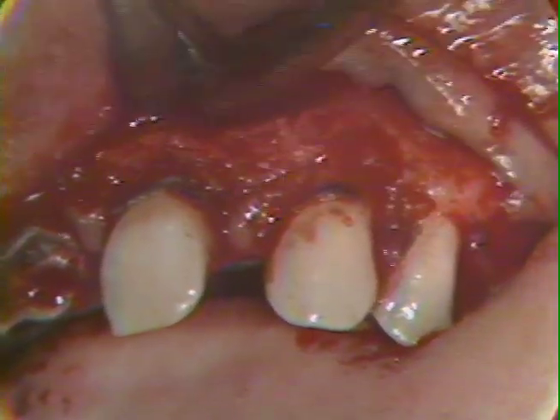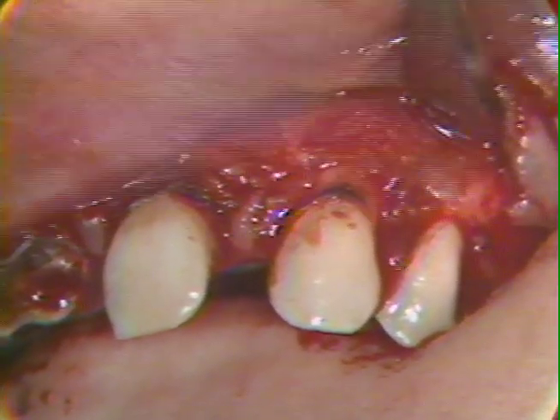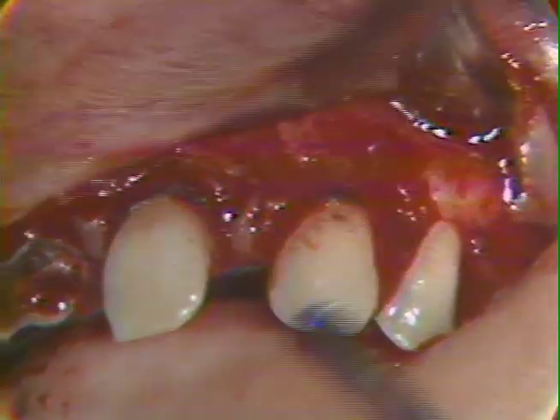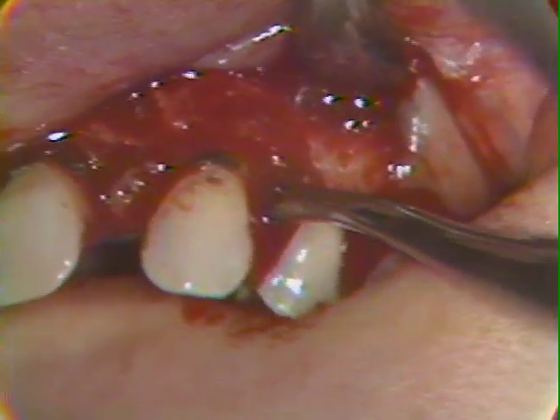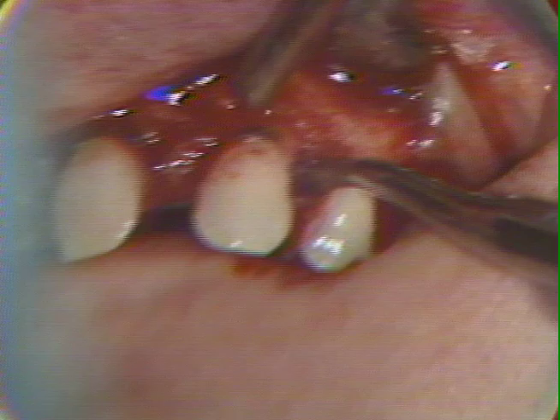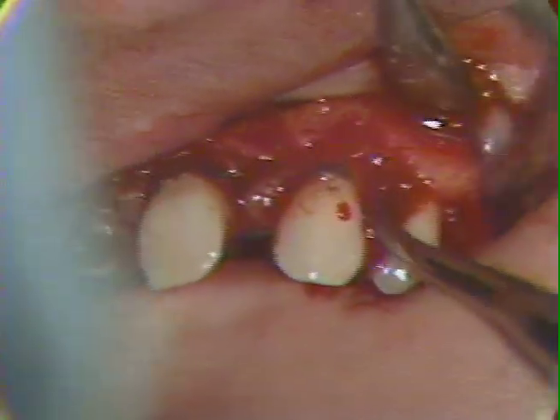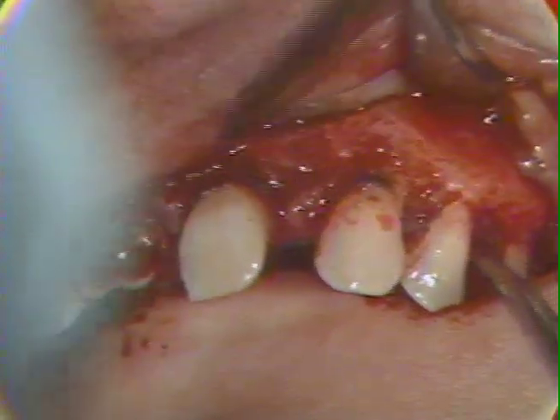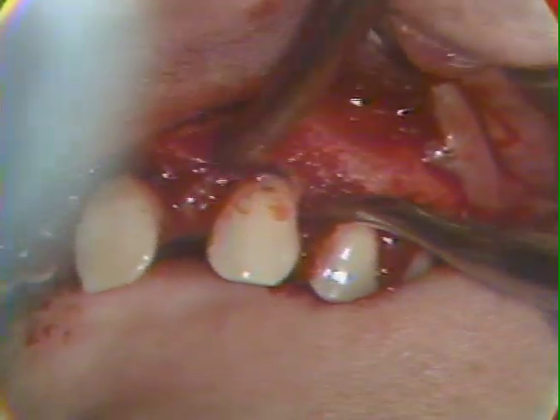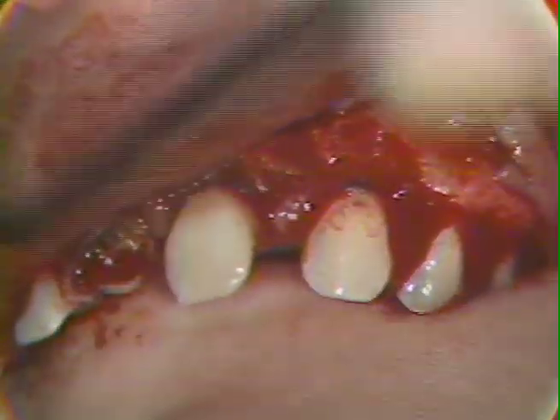We also, in this instance, since all these teeth are to be removed, can employ the elevator as a means to luxate them partially before they are individually removed. One has to be very careful in the application of elevators as to the vectors or the forces that are generated. But here we are going to take all these teeth out, so there's no problem in that distribution.